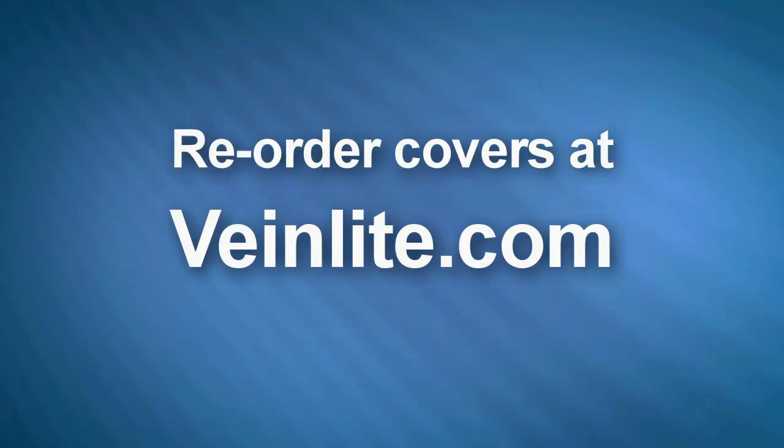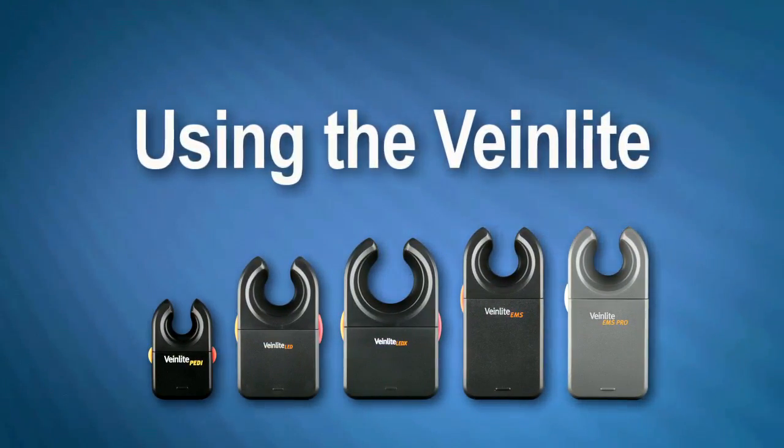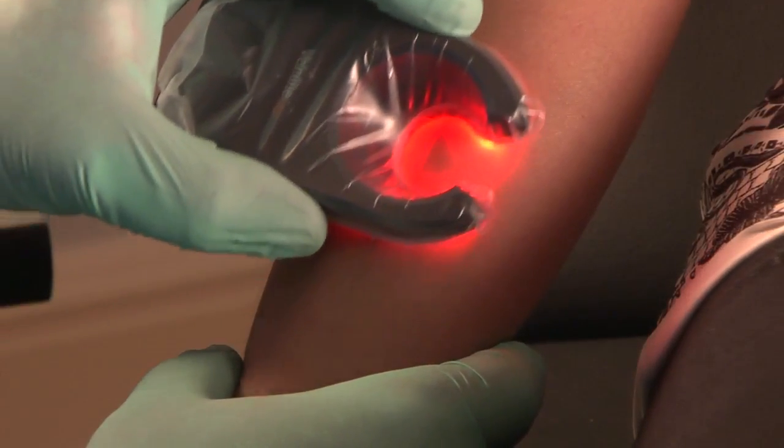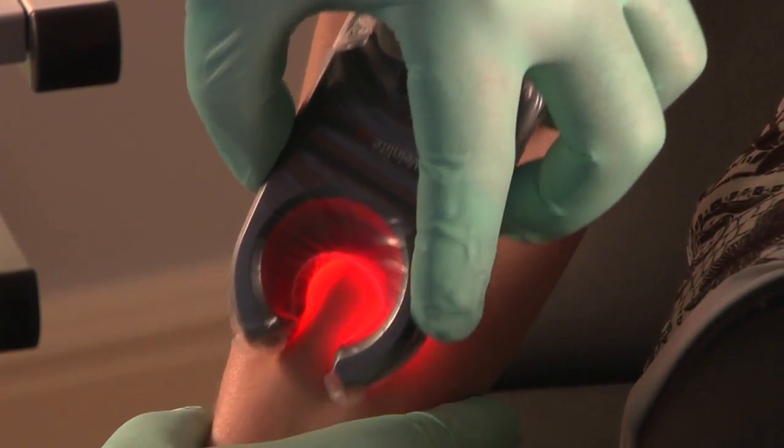Covers can be reordered at Veinlite.com. As you scan for veins, the device should be in direct contact with the skin with slight pressure applied.